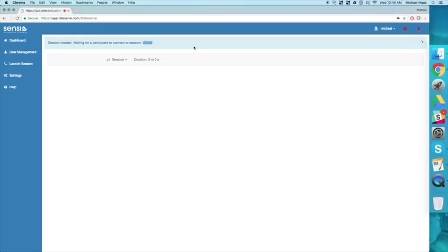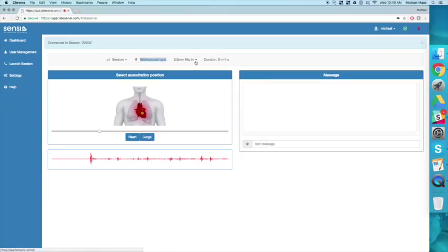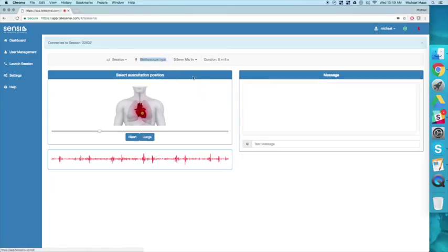After they have entered that session ID they will join the session, and then at the top there you'll see a stethoscope type drop-down box where you can select between the Littmann and the 3.5 millimeter mic in.